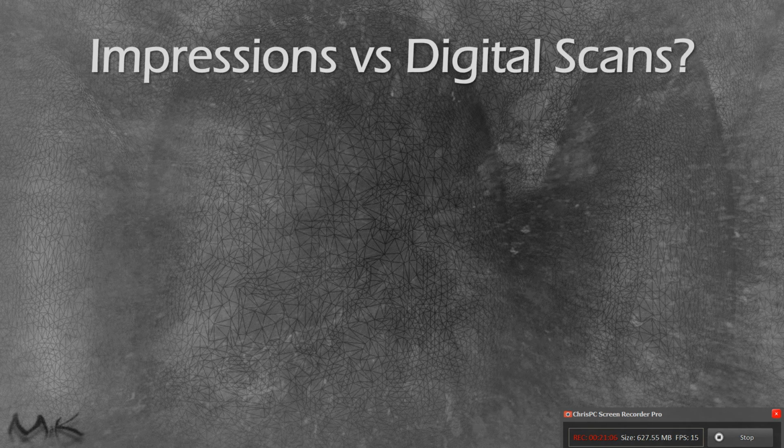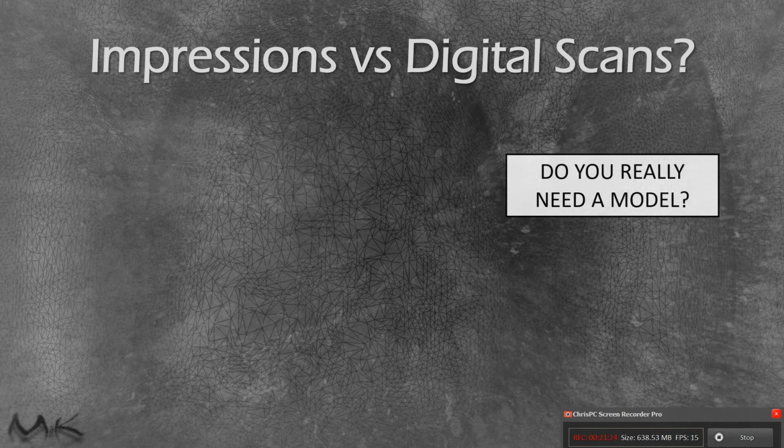So when we talk about impressions versus digital scans, this is where we start to think, okay, I bought a digital scanner so I could send files off to the dental laboratory, so I can mill crowns in office, but I haven't really ventured into the world of 3D printing yet. Why would it be beneficial in my practice? Well, I ask you the question, do you really need a dental model?